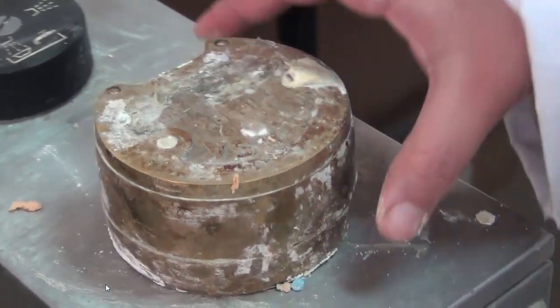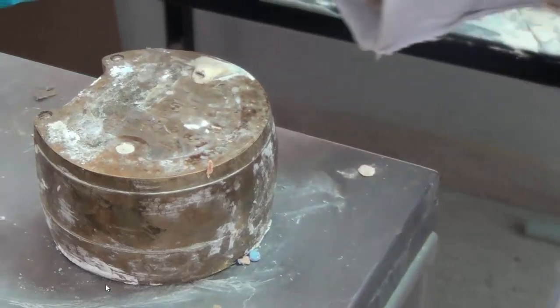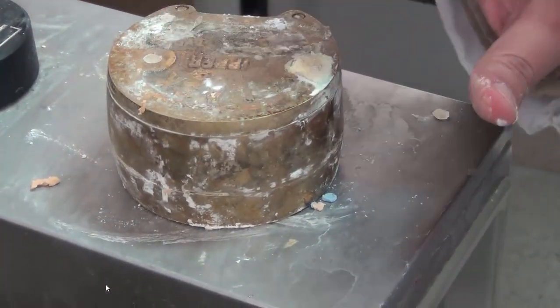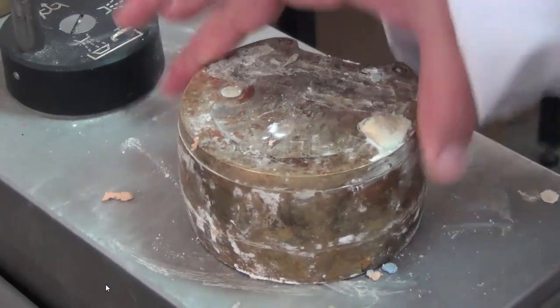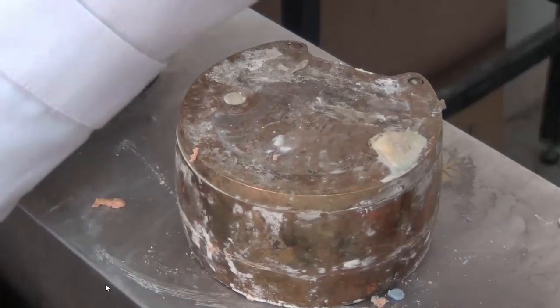Now we need to eliminate the wax layer. We call it DEWAXING, when we want to eliminate the wax. So when this is set, we prefer more than 1.5 to 2 hours to make sure it's well set and it will not dissolve while we're using this hot water. We place it in the DEWAXING machine. So we place it first in the chamber inside.